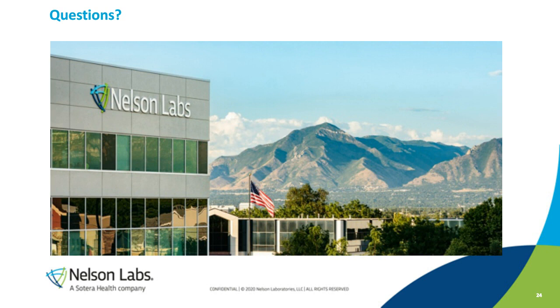But we feel like going out longer than that is really excessive. And when you do go out longer than that, you run the risk of losing compounds and compounds degrading. And there's a whole host of issues that arise. So normally we make that type of explanation that 50 degrees C, 72 hours is more than a factor of 3 conservative compared to what we expect in the body, notwithstanding how aggressive those solvents are compared to the body, and that anything more than that is both too excessive in terms of conditions, and it introduces uncertainty and risks related to compound recovery.